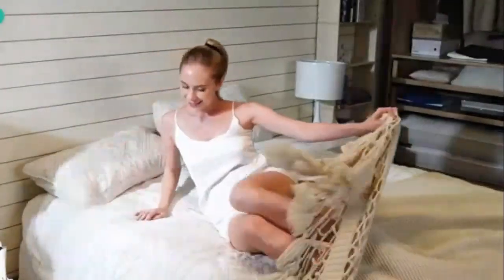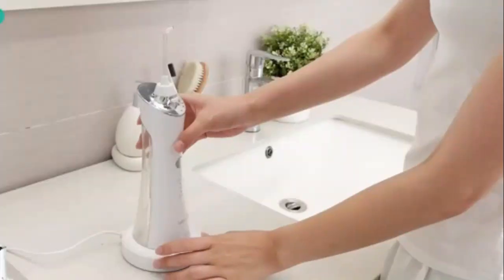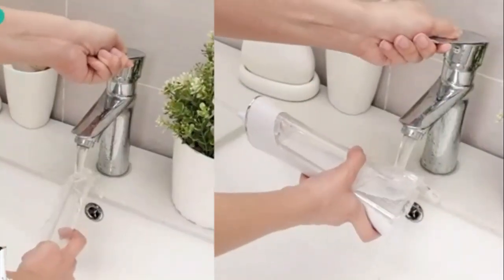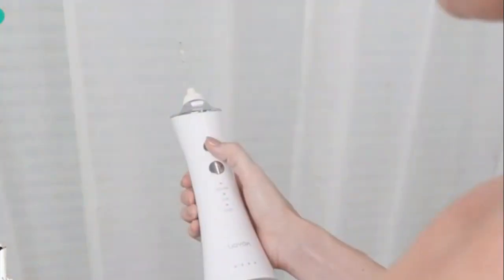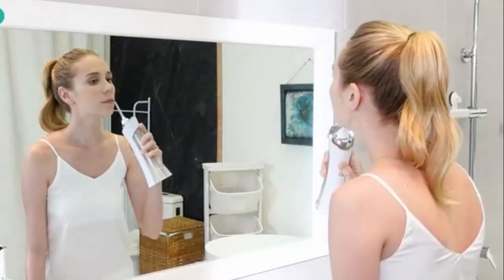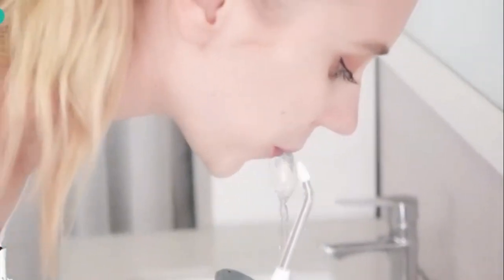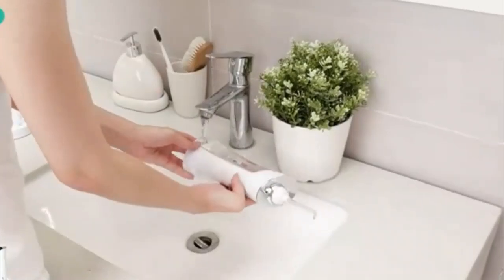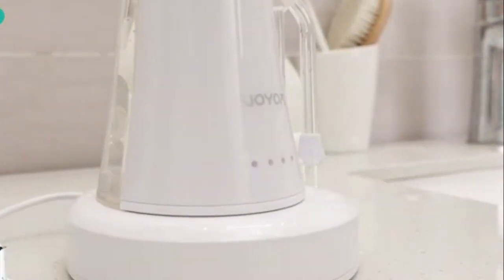Experience a deeper clean with the MySmile LP221 UVC Sterilizable Cordless Water Flosser. This innovative device uses powerful water jets to effectively remove plaque and debris from hard-to-reach areas, promoting better oral hygiene. Equipped with UVC sterilization technology, it ensures your flosser stays bacteria-free between uses. The cordless design offers convenient portability, while its long-lasting battery provides extended use. Pair it with alcohol-free mouthwash for a gentle yet effective clean that won't dry out your mouth. Perfect for those who want a professional-level clean at home.